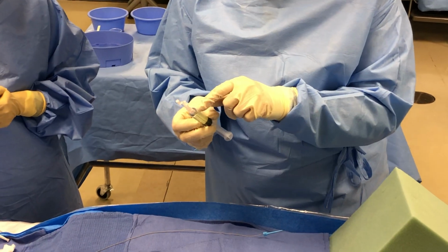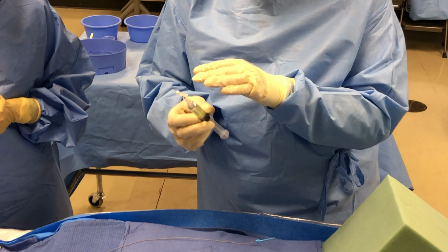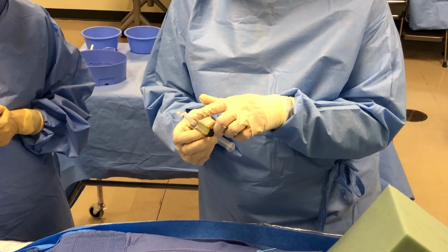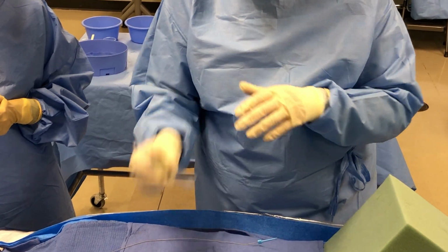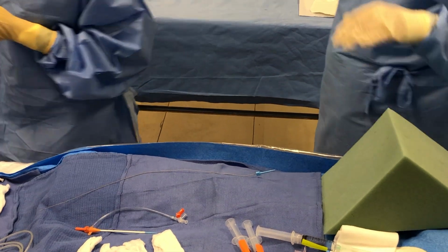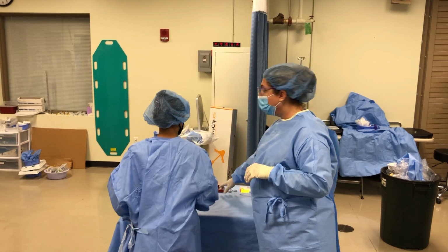Because you're going to need to get more lidocaine and you're going to need to reuse this needle, you're going to have to be very careful. Not all places have the safety needles. So when you go to take this needle, no matter which way you take it, turn away, come back here, and lay it next to my sharps box.